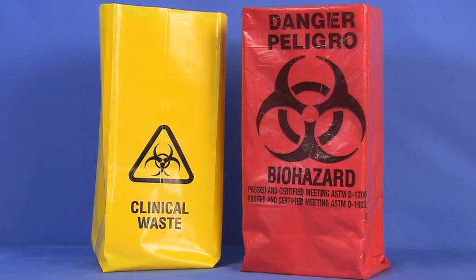While biohazard bags come in various colors, they can be identified by the universal biohazard symbol. Please check your institution and state regulations to confirm which bag is used.